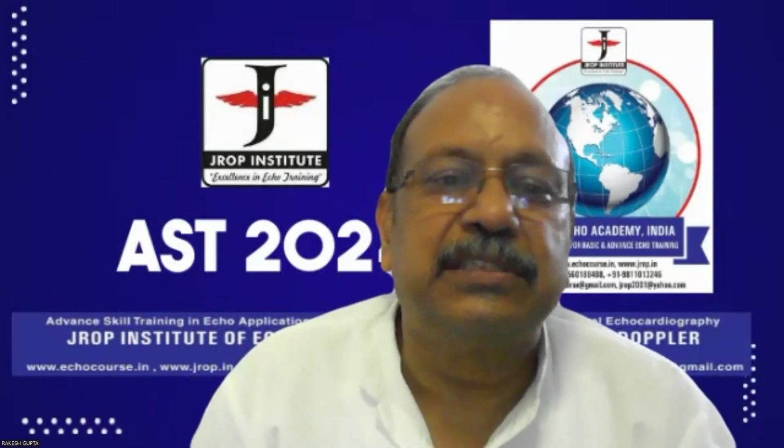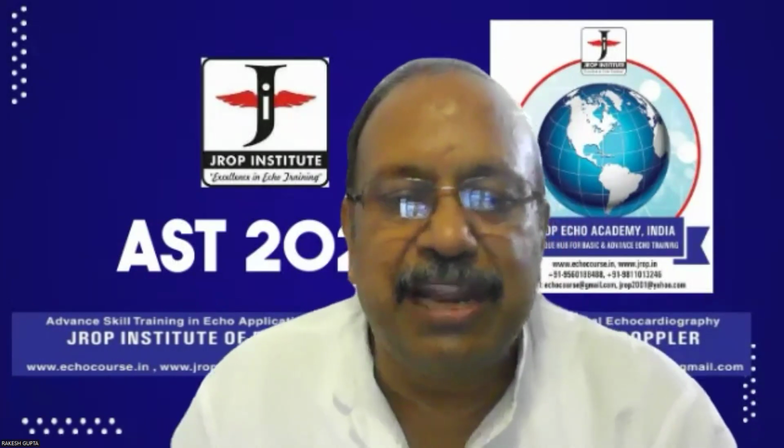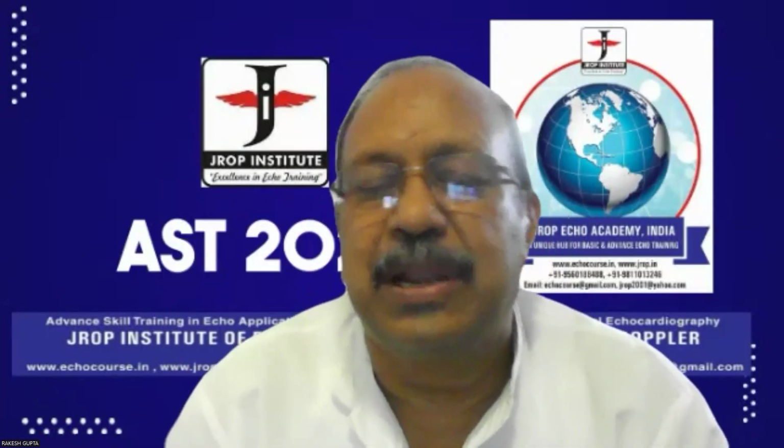Remember 5 parameters. Tanmay, go ahead. Remember 5 parameters: E/A ratio, E prime septal, E prime lateral, LA volume index, and TR jet velocity. And believe my words, we do this virtually in every subject who walks into our lab.